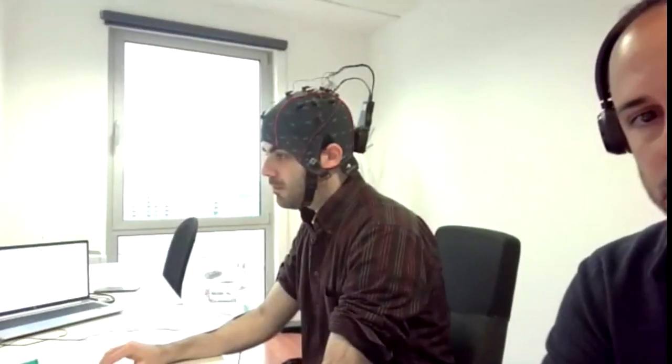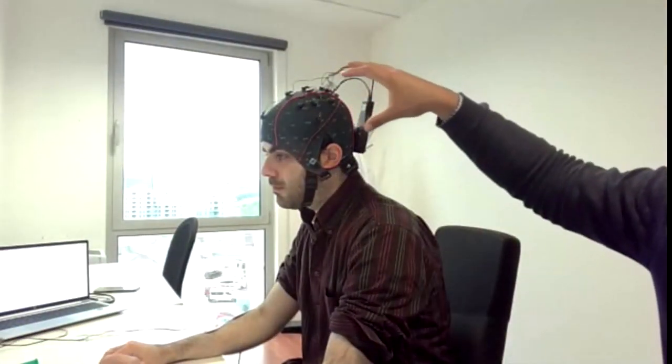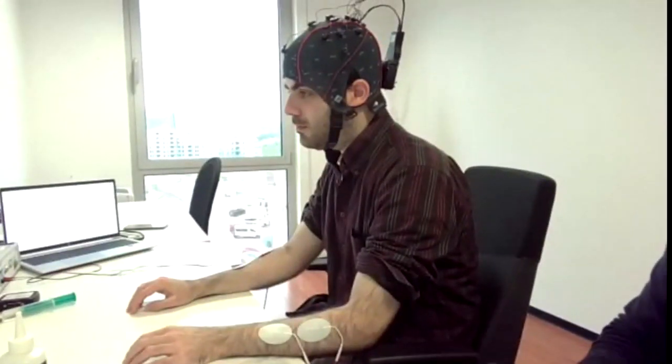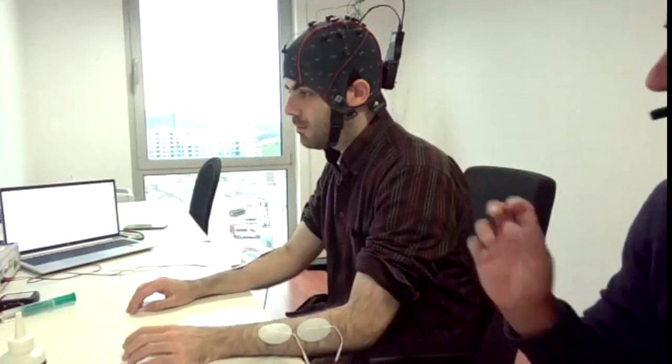So I think that you have some questions in the chat. Reza is asking which part of the leg the electrodes are connected to. We place the electrodes over the tibialis anterior muscle, the muscle just below the knee on the frontal side of the leg. But this is essentially the recoveriX treatment. So we gel the EEG cap, we place the FES electrodes, we calibrate the FES stimulation, and we can start.